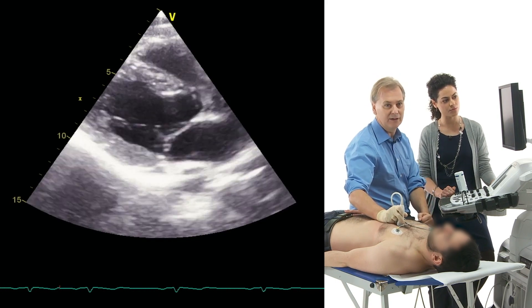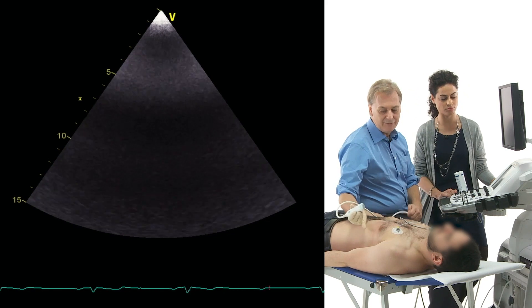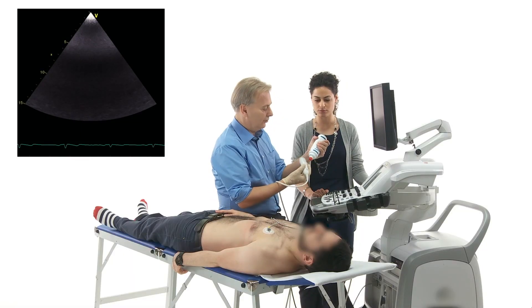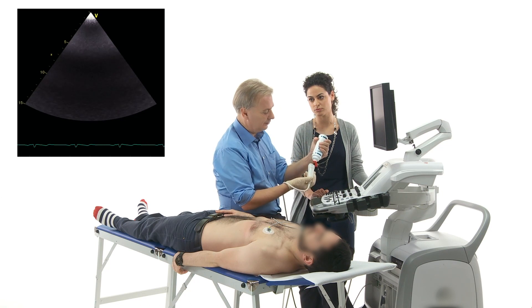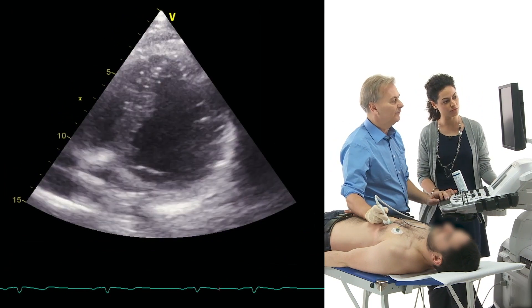Sometimes you will get better image quality there. You can also get an apical view. The problem here is the lung, because the lung is on the lateral side interfering with your image, and if the patient is lying on his back the heart might be at least partially hidden behind the lung. To avoid this, the trick I usually use is to image from a little bit more medial — in other words, closer to the sternum.